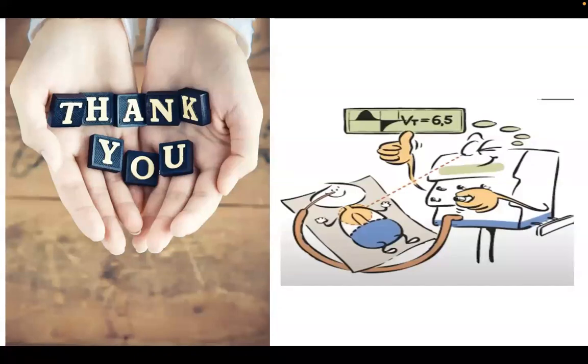I think all of us are using it. And another important thing is that most of the time, for the initiation of ventilation, it is better to start with the SIPPV.